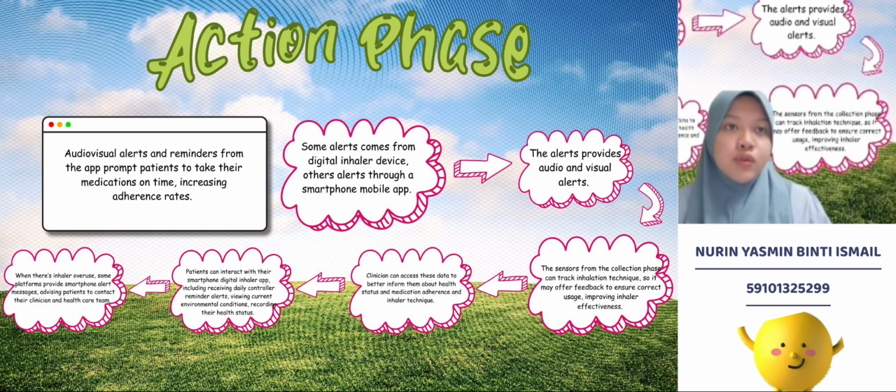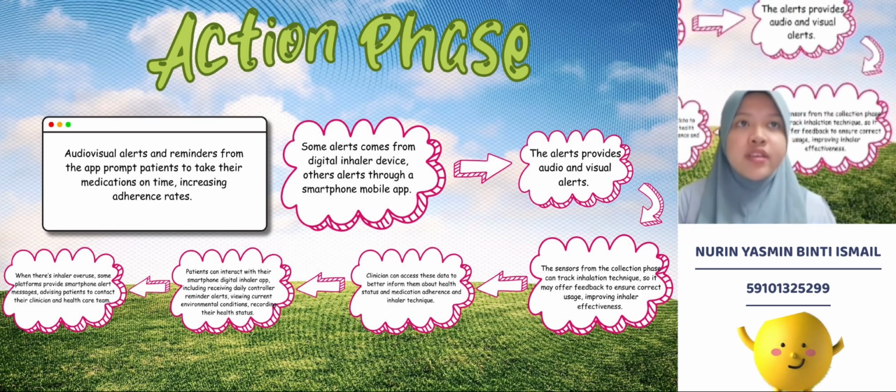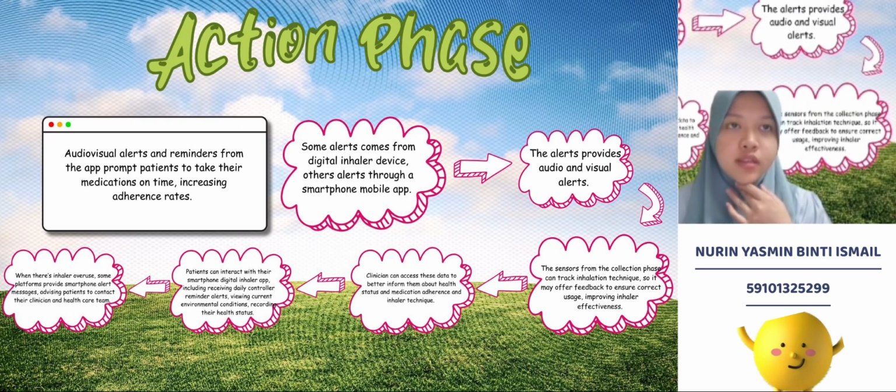As we know from the collection phase, the sensor can track inhalation technique, so it may help ensure correct usage, and it will also improve inhaler effectiveness.